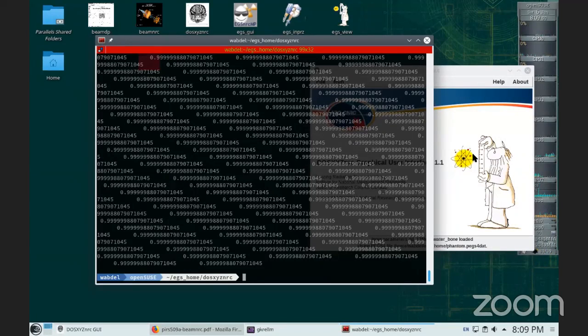There are some prerequisites, and you can post questions on the page, because when you want to launch something new, it's good to ask. Read the instructions carefully. You need prerequisite software. But one thing you need to do, you need a dedicated Linux machine to do the simulations. Even if you run MMCTP on a Windows machine, you need a dedicated Linux machine for the simulations. Otherwise, this is not going to be practical at all.